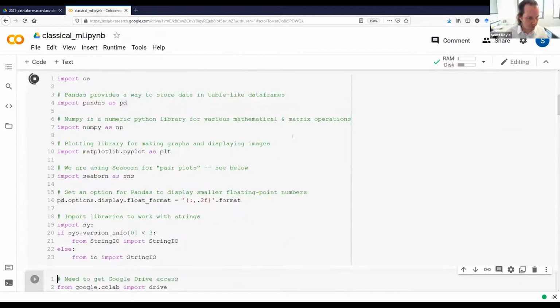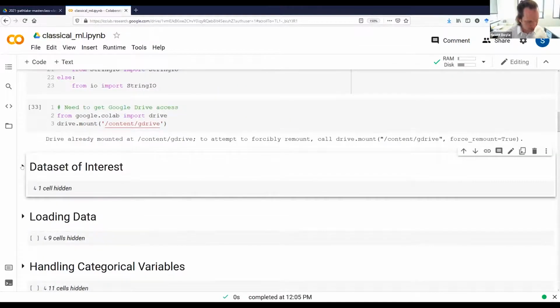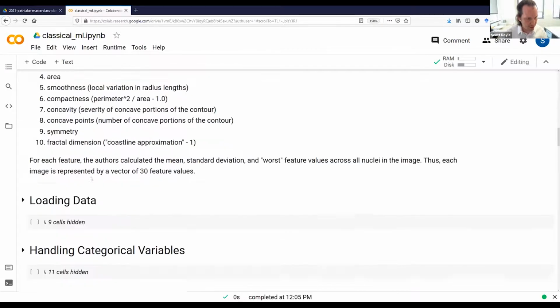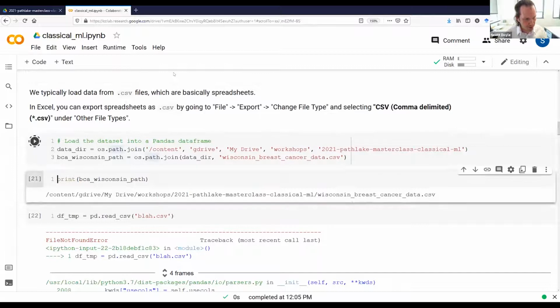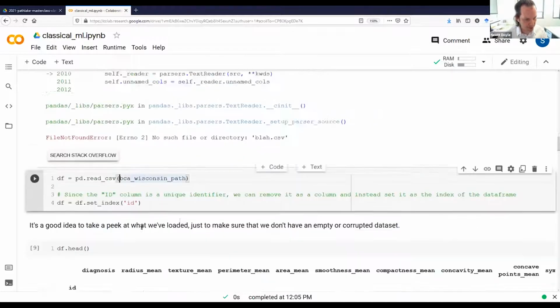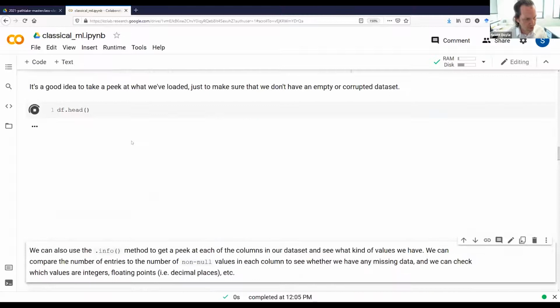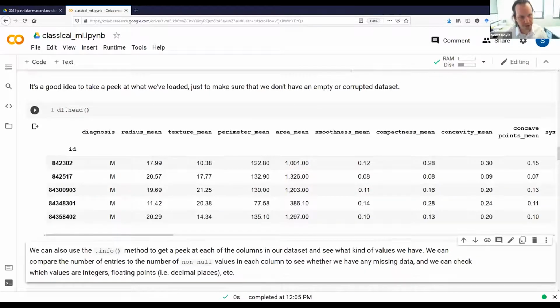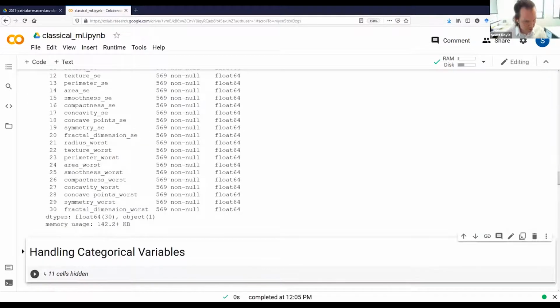So I'm just going to go through, and what I'm doing right now, just keyboard shortcuts, I'm holding down Shift and hitting Enter, and that will execute the code cell that you're on. So again, we create our path, print out the path. I'm going to skip this because that was my example from before. I run this again to make sure, okay, so the data frame is in Python's memory. View the info, make sure everything looks good.